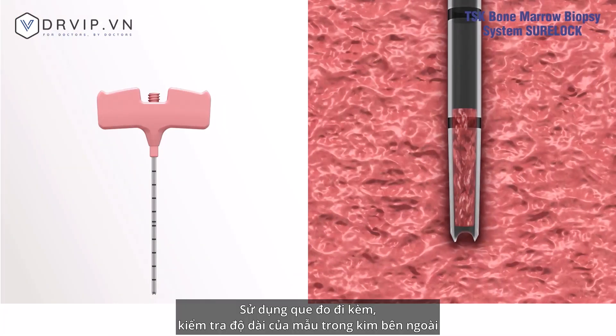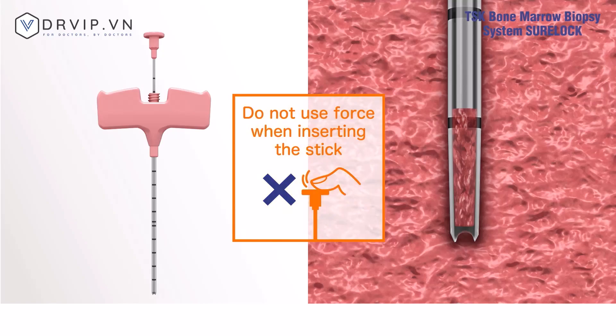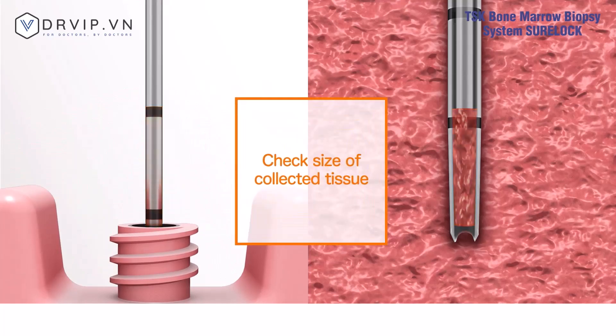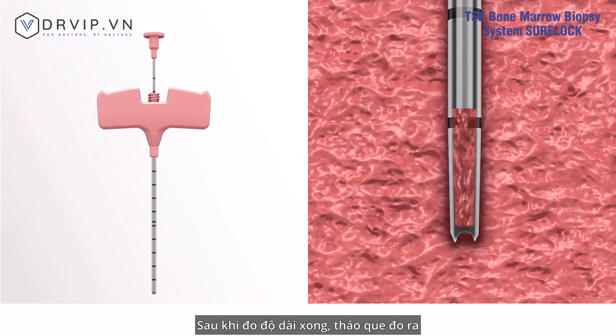Use the provided measurement stick to check the length of the tissue collected in the outer needle. Do not use force when inserting the stick, to prevent crushing the tissue. After checking the length, remove the stick.